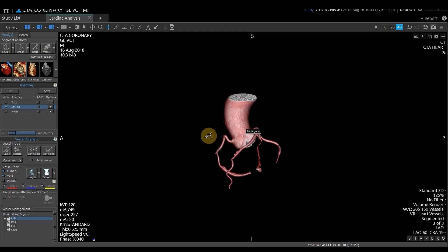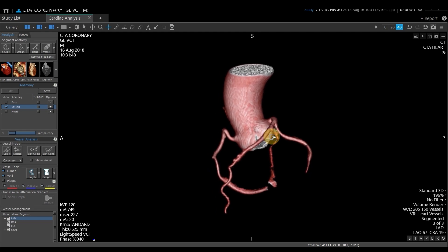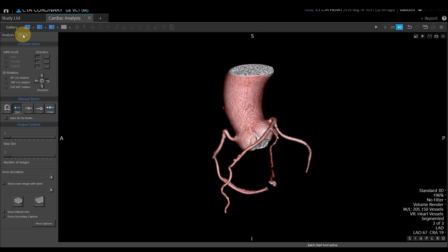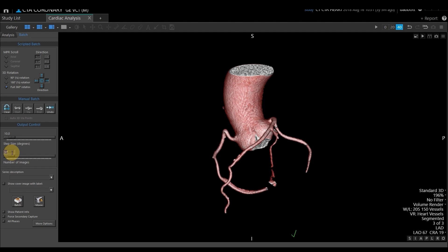If you would like to create a batch or save an image, I like to zoom in by rolling the mouse wheel to fit it to screen. In the upper left-hand corner, select Batch. I'm going to do a full 360-degree rotation. The globe and check mark directly next to it show you the direction of turn. I can select the degree of spin or the number of images using a slide bar or by typing in your own number — I'm going to hit 25, hit Enter. I'm going to label this 3D Spin and select Batch. That's going to save that batch.